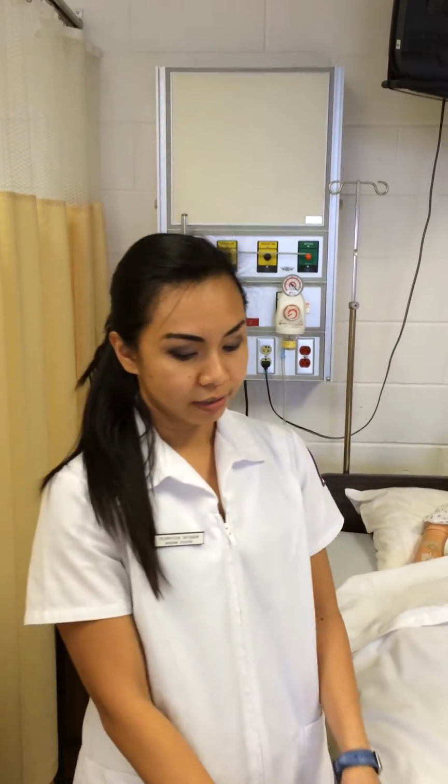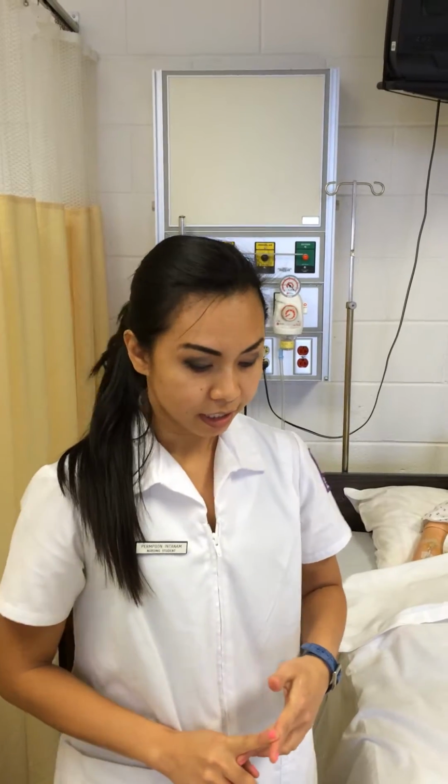I am going to set up an IVPB bag and change a gown for validation. So first, we begin with the 7 steps. I check the physician order, I introduce myself, I identify the patient, I set up my equipment, I wash my hands, I explain the procedure, and I provide privacy.